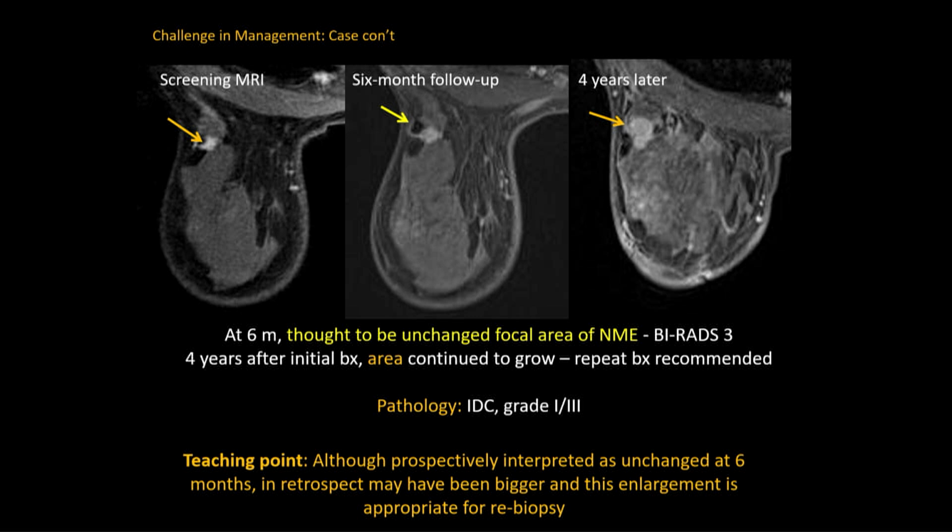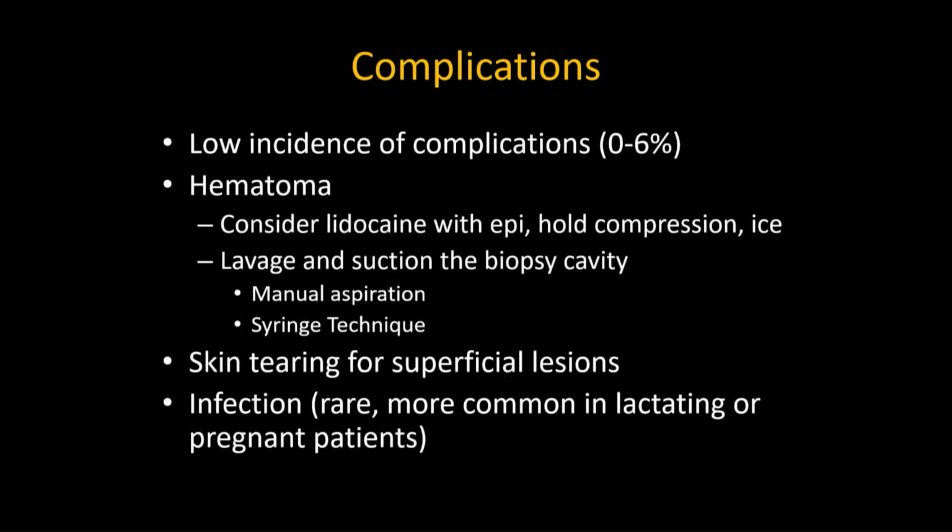And unfortunately, like some of our patients, this happens. The area continued to grow at 4 years after the initial biopsy. So she didn't come back until 4 years later. You can see now the mass has increased in size. Repeat biopsy was recommended. This is a grade 1 IDC. And so although in retrospect this was thought to be unchanged, it really should have been smaller or given some evidence that it was biopsied appropriately.